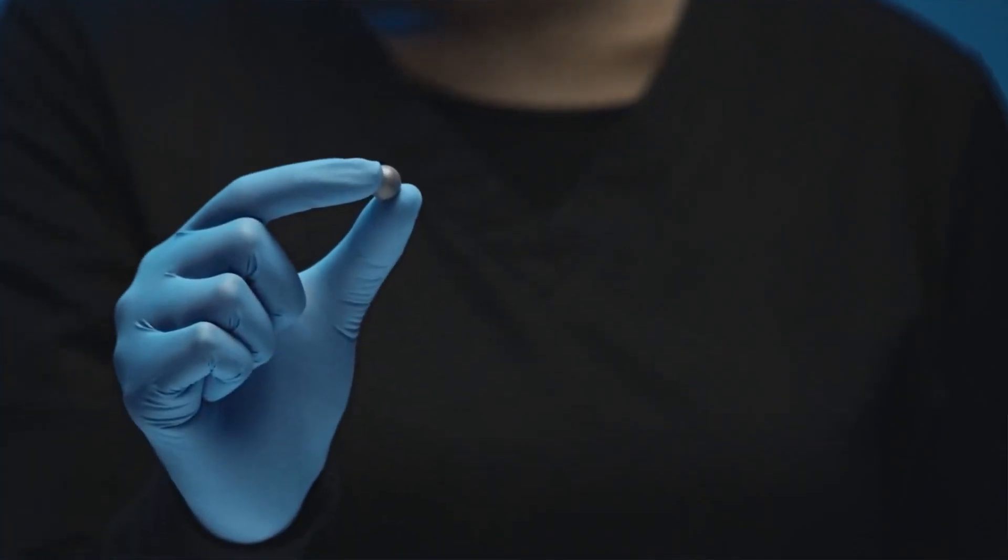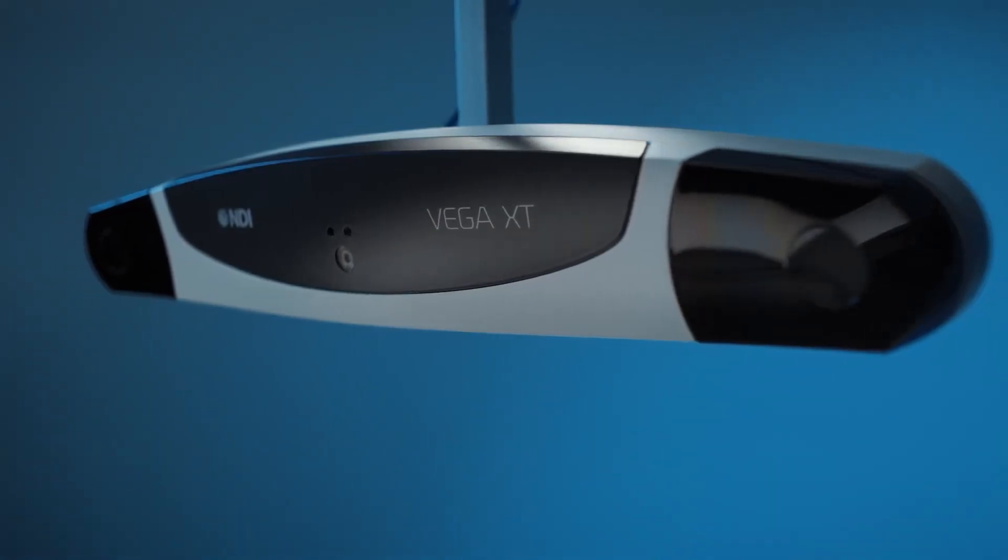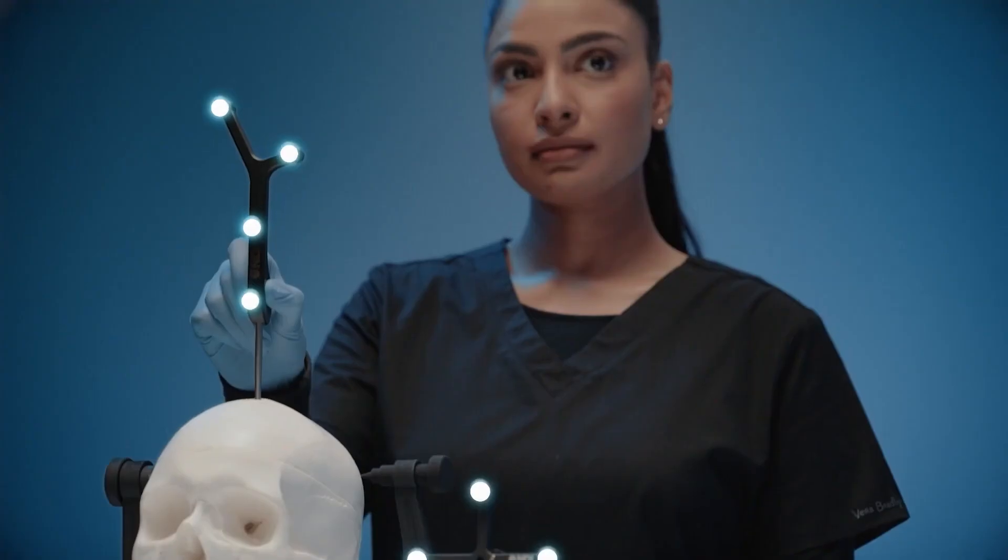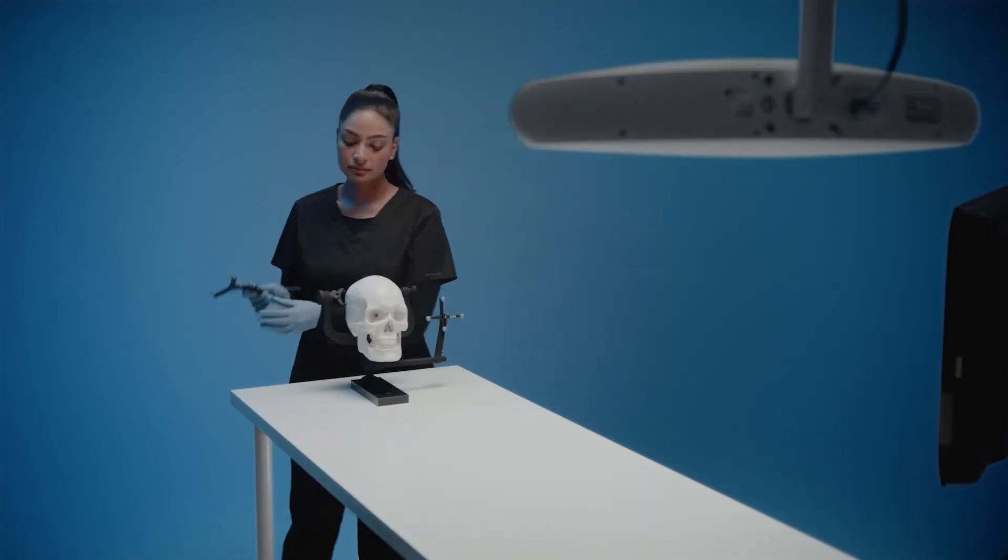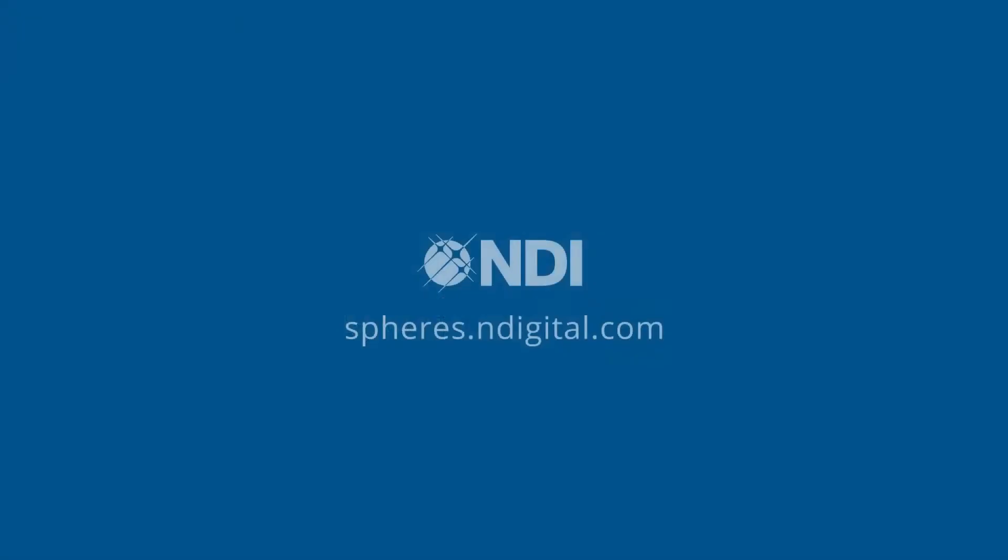NDI passive spheres are used to calibrate the NDI Polaris optical tracker during factory calibration. They are engineered to maximize optical measurement performance. For more information, visit spheres.ndigital.com.